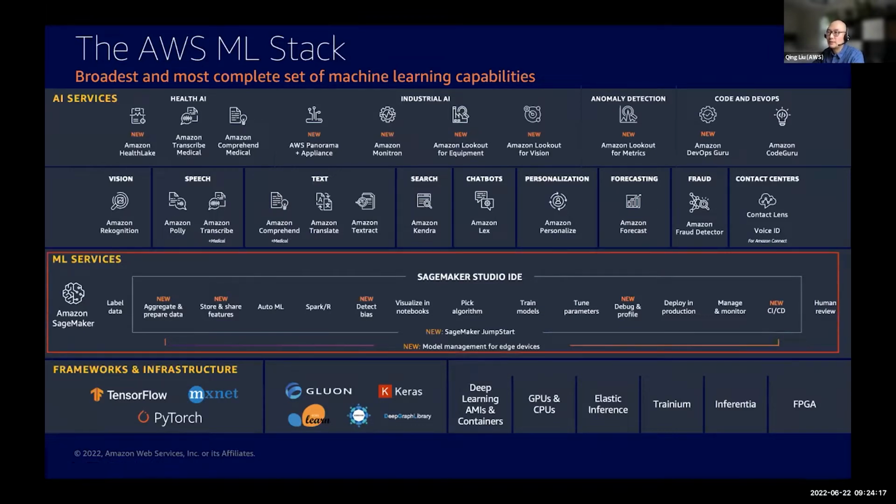This is included in the workshop content, but we are not going to be focusing on this service today. SageMaker gives us an easy way to train machine learning models.